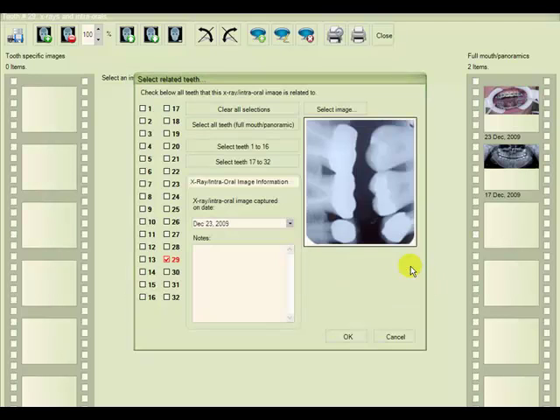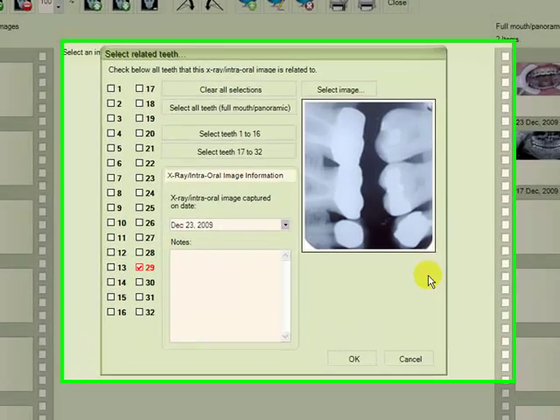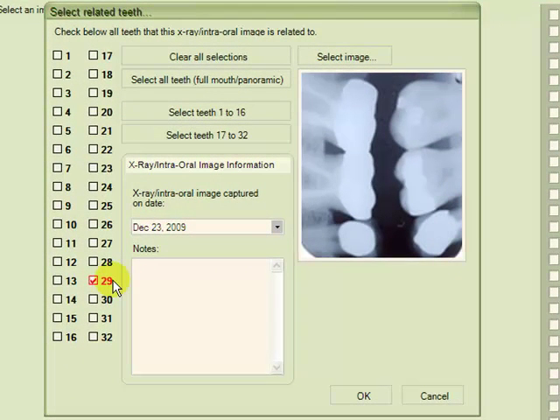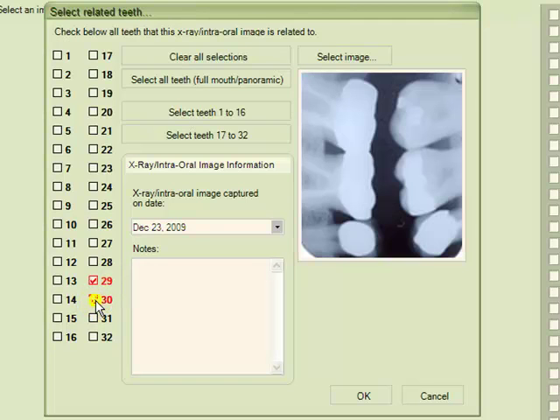At this dialog window you can mark the relevant teeth or tooth to which you would like to link the X-ray. As we see here highlighted in red is number 29 which is the tooth we began with, and we'd also like to link it to 30 and 31 as well.